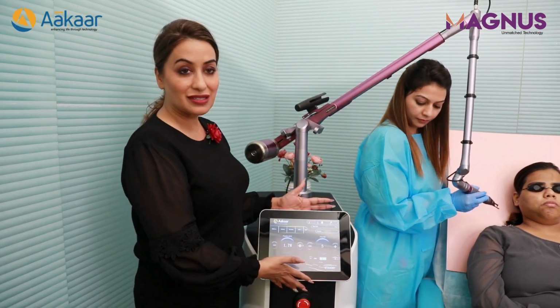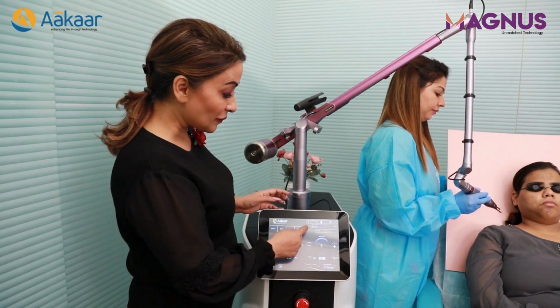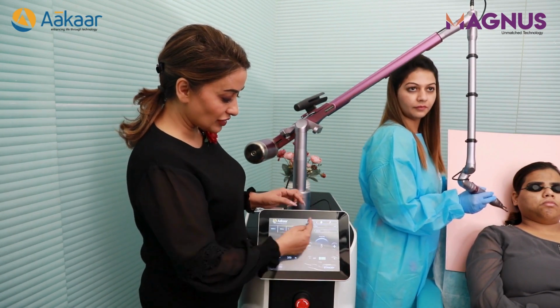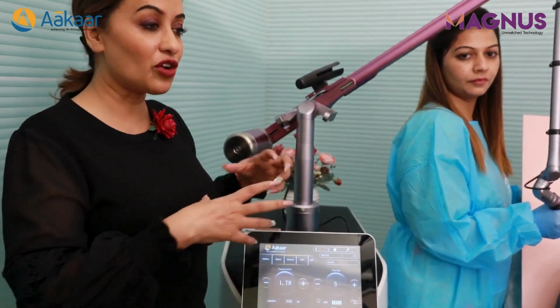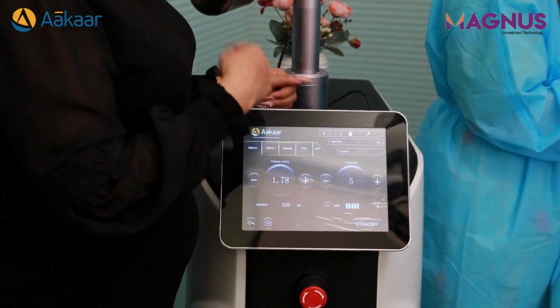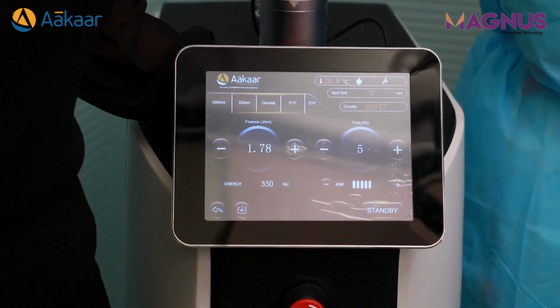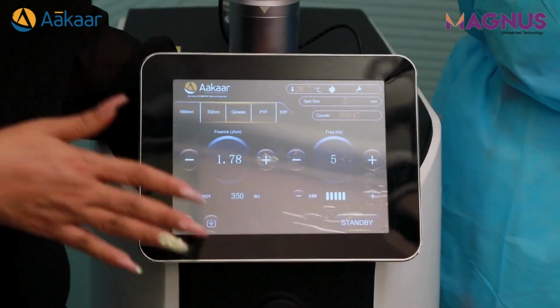Let's first understand what it is. So don't get confused if you are seeing it for the first time. Of course, the top gives the temperature. The room is air conditioned right now, but because we are shooting this, there are a lot of people, so the temperature has gone a little high. Please make sure that your rooms are at optimum AC, because that will ensure the life of your machine.